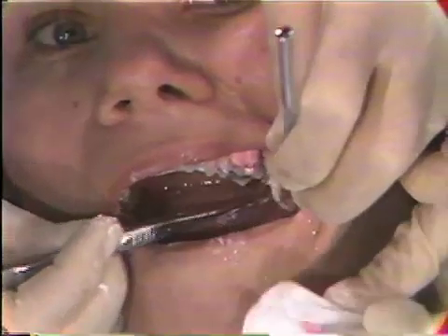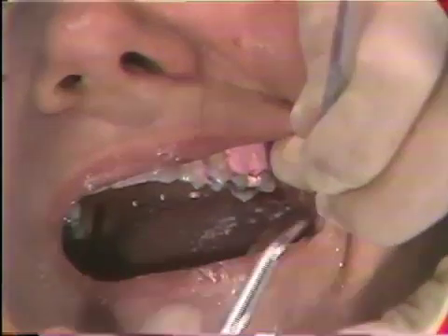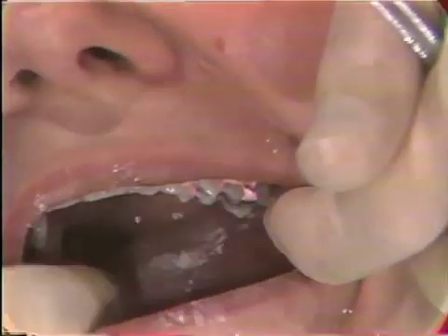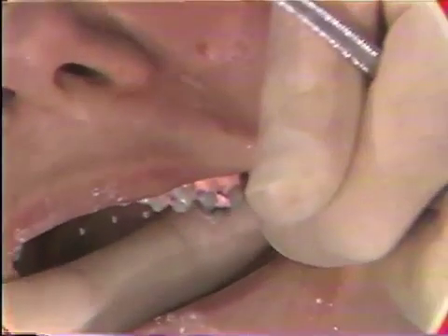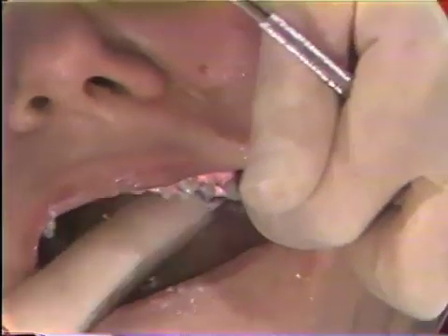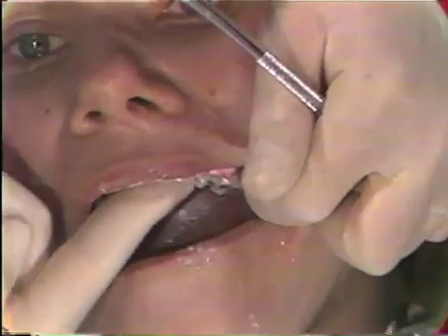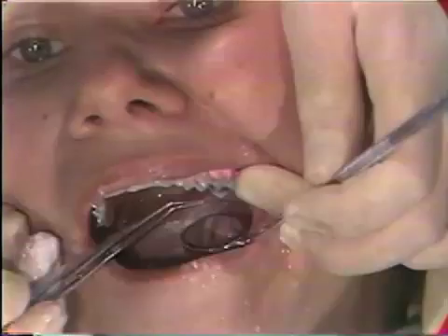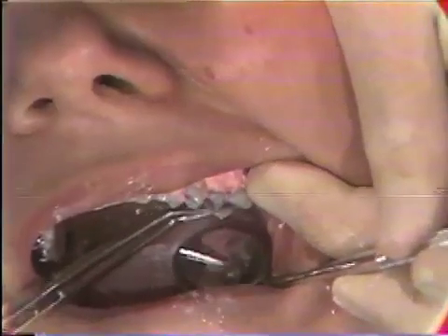There's some excess material, so that will be removed with the tweezers by merely squeezing the dressing and then taking it away slowly. If you don't watch it when you squeeze the dressing, you're apt to have the dressing stick to the tweezers or come along with you. A finger is placed in the mouth to get some saliva on it before going on the distal side of the second molar, to press the buccal and lingual portions of dressing against the distal of the tooth, making the dressing conform to the anatomy as much as possible so it's minimally bulky to the patient, which means the patient is less apt to play with it.